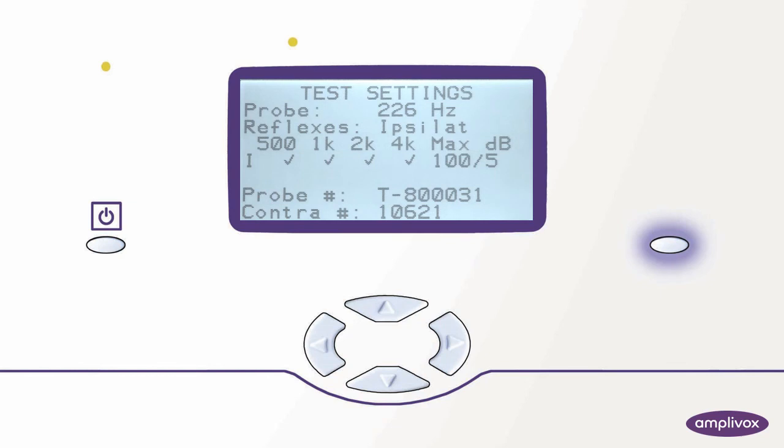When we now select the display mode button again we can see that our test settings contain ipsilateral reflexes for all four frequencies and that we test up to 100 dB.